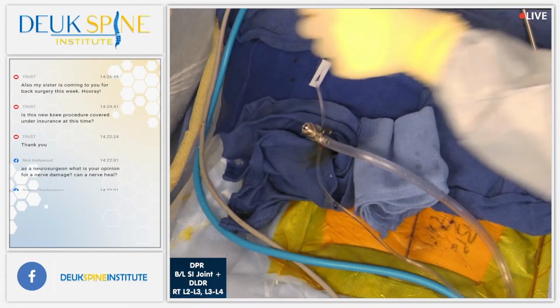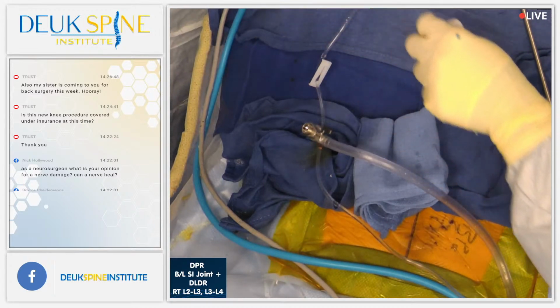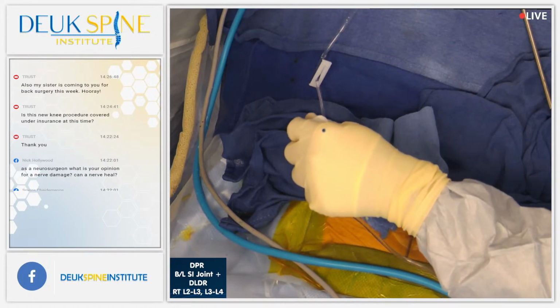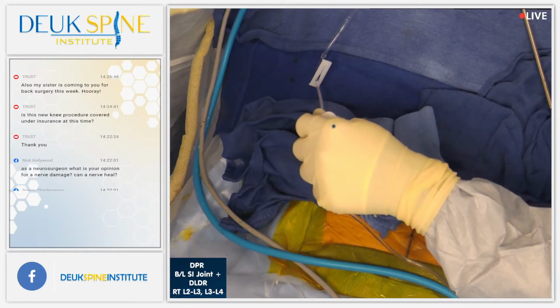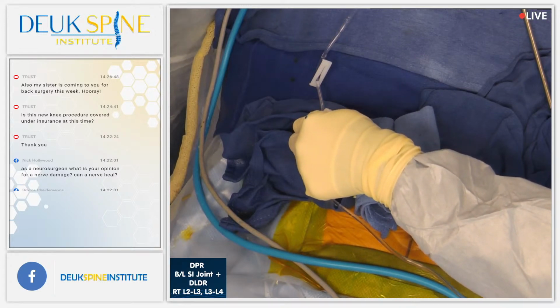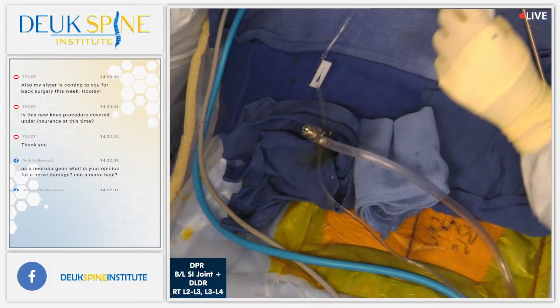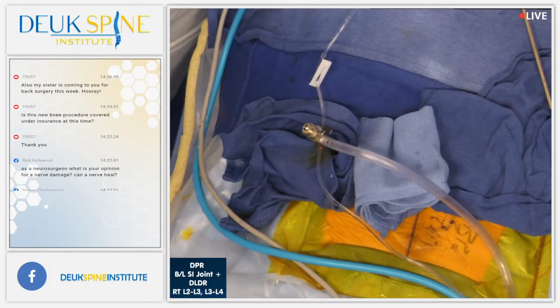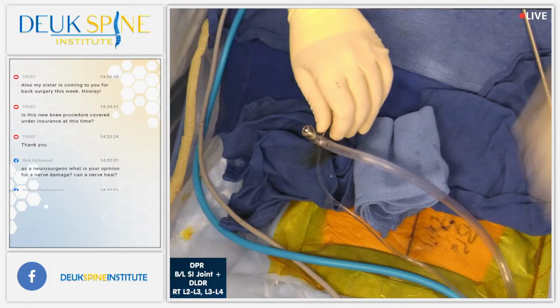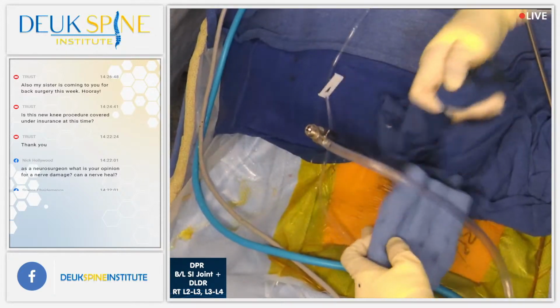I see it. Yeah, it's hard. Got a little bit of that calcified stuff in there. All right. That should be it. All done.